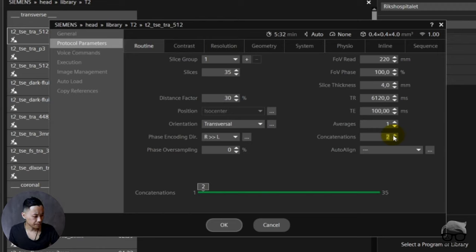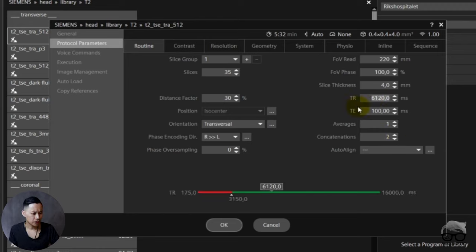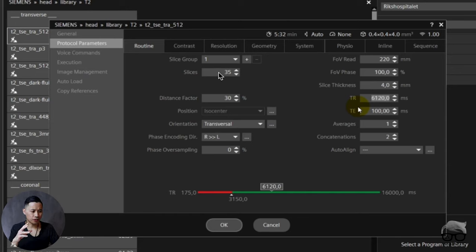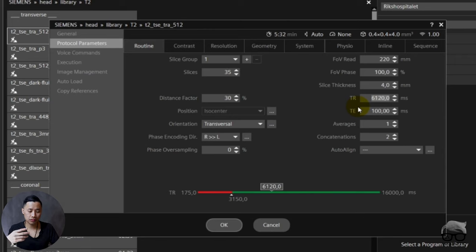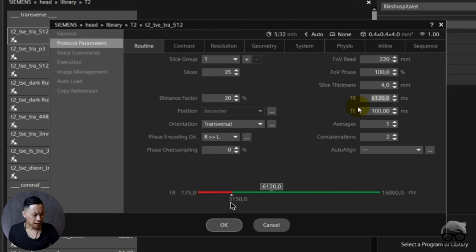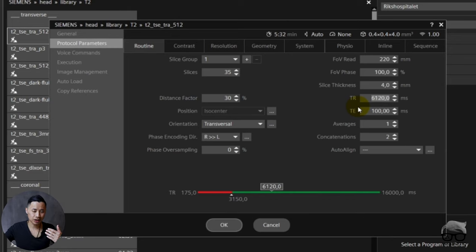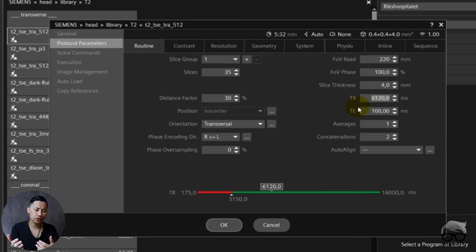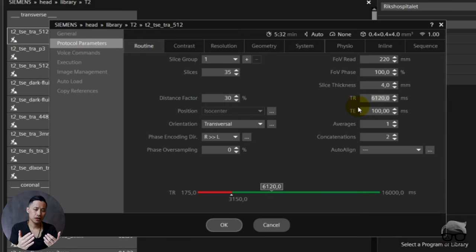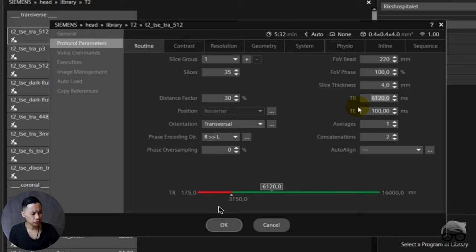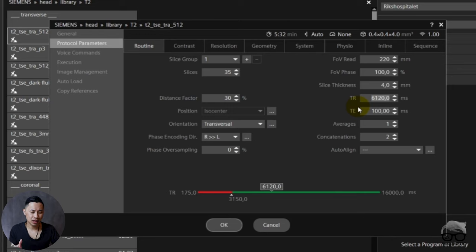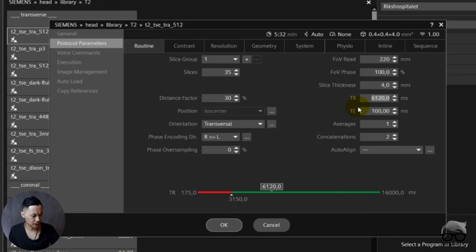But what can we do about this? Look, now suddenly we have of course room for double the slices. 35 times 2 is 70, of course, because now you have two concats. And now we are also able to either increase the slices and use the whole TR, or you can decrease the TR. If you decrease this to 3150, you will save scan time and at the same time still be in the range of a T2-weighted sequence. Look at the scan time: five minutes and 30, and now we're suddenly at three minutes.